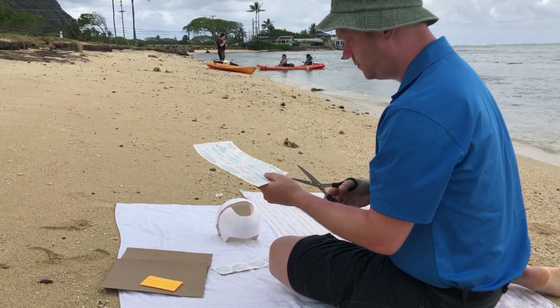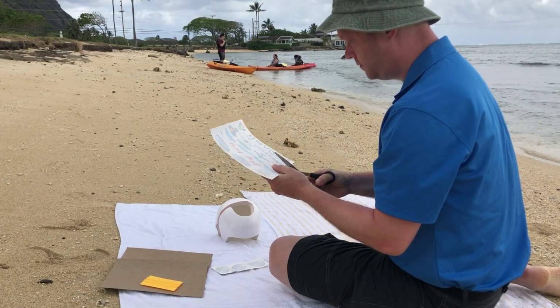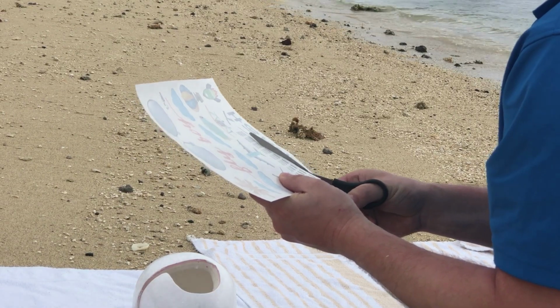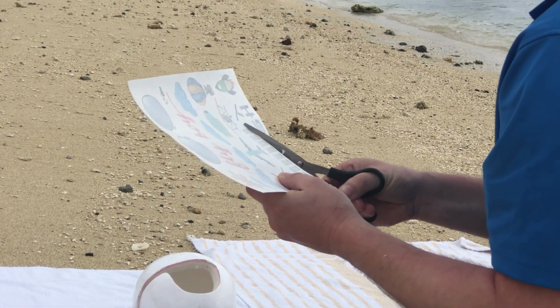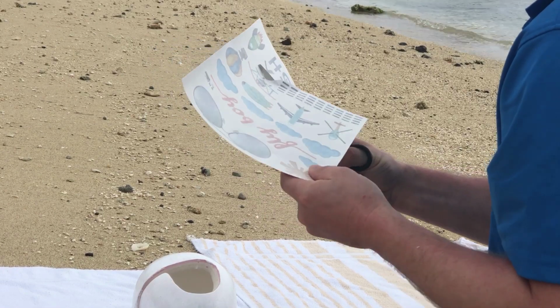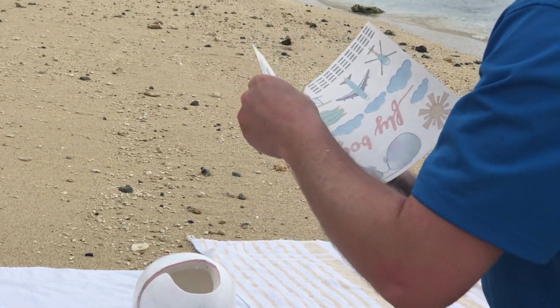Today I'm going to demonstrate how to apply vinyl decals to a cranial band. You will receive your design on one page like this. There is transfer tape on the front, and the first step is to cut apart each element from the page.